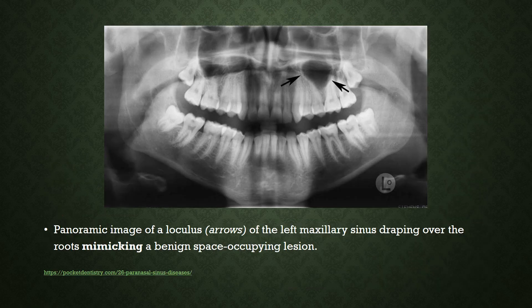This panoramic image shows a loculus of the left maxillary sinus with draping of the roots, mimicking a benign space-occupying lesion. But in fact, it is just the maxillary sinus appearing like a large cystic area.